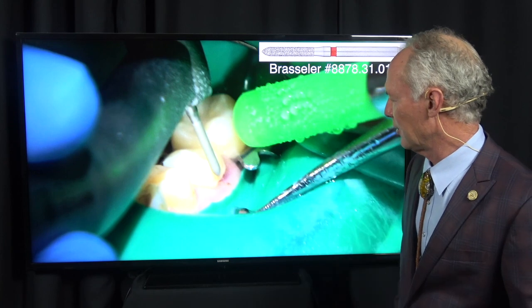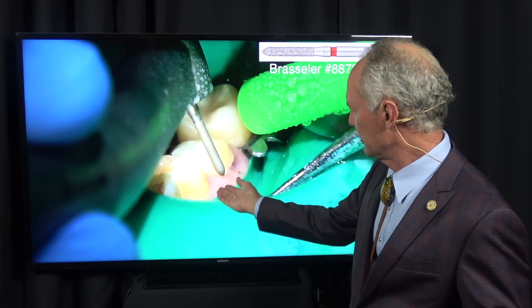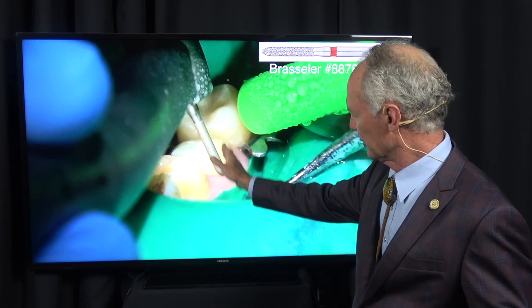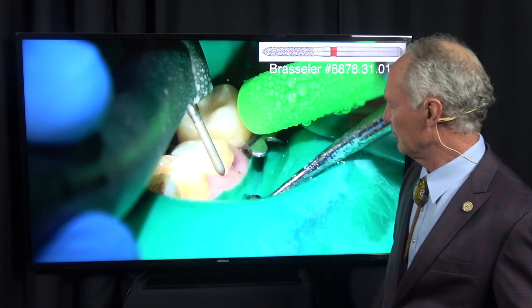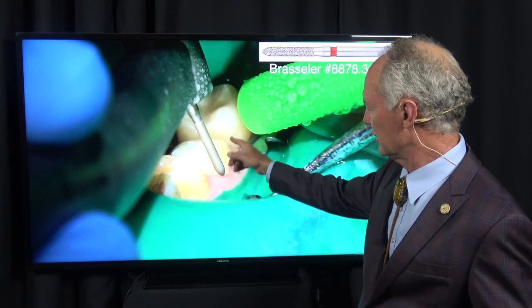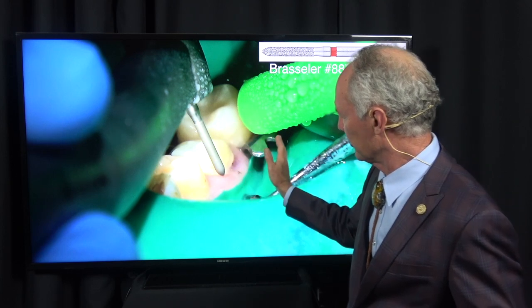I'm using that for the margin, since this tooth is not in the aesthetic zone. There's no reason to prep subgingivally. Then you've got a big super bulge on this tooth. So if you remove all that super bulge to prepare subgingivally, you've removed a lot of tooth structure unnecessarily. If you just prep to the cemento-enamel junction, which is in the midst of that super bulge, you're preserving all that tooth structure. And especially if you've had a root canal procedure on a tooth, the tooth will become a little more brittle over time. You want to preserve as much tooth structure as you can.